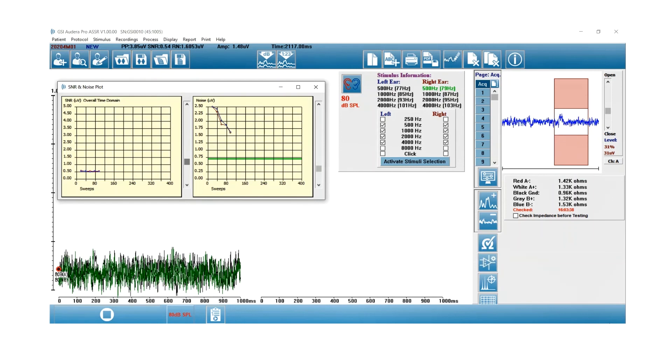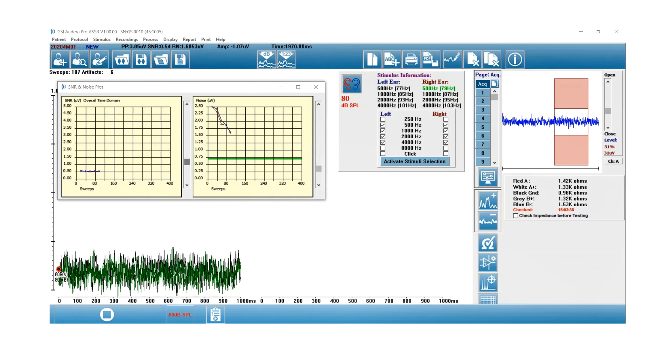Once my data has updated, that green has gone away in the left ear, and that's probably because the response that was detected was very small, maybe borderline. So as the test is updating, you may see that frequencies become significant and then bright green and then change over time.